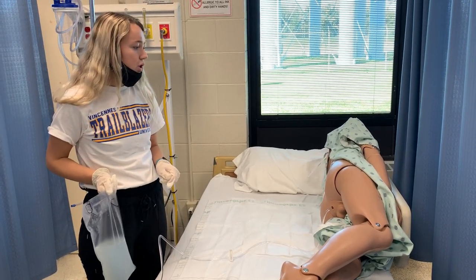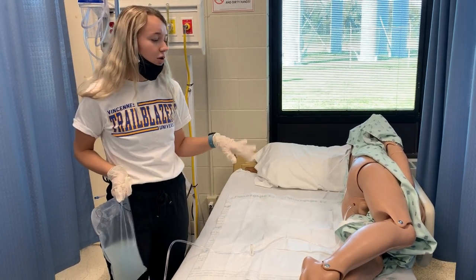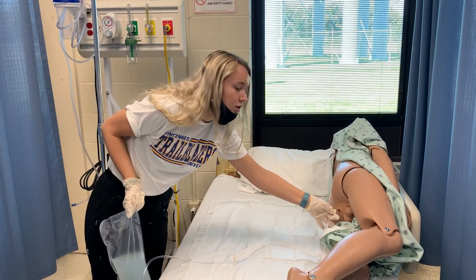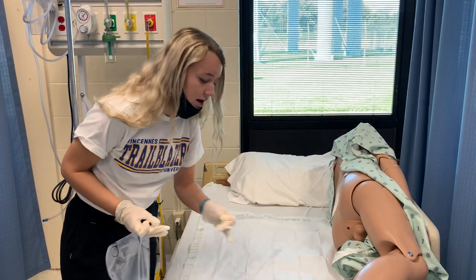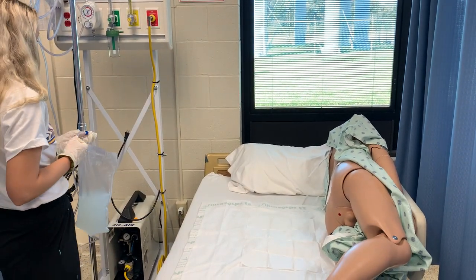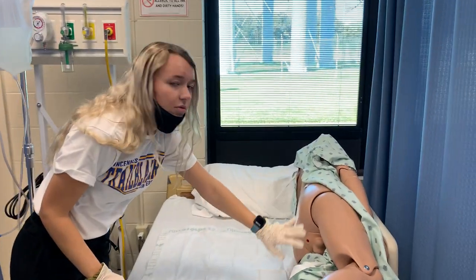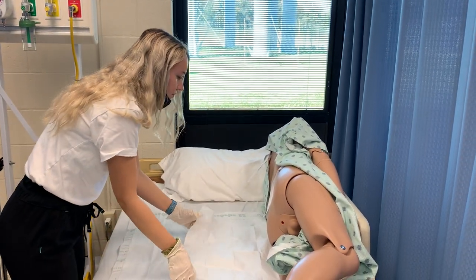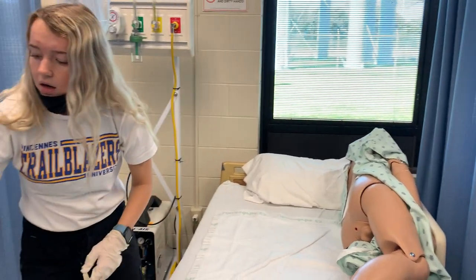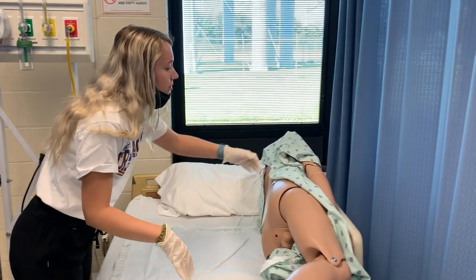You want to make sure to check on your patient and tell them to deep breathe. Make sure that they're retaining all the water and solution that they can. Once you're done, take this out, clean all your supplies, clean up the bottom, remove the pad, and make sure they either have a bedpan or a bedside commode nearby.